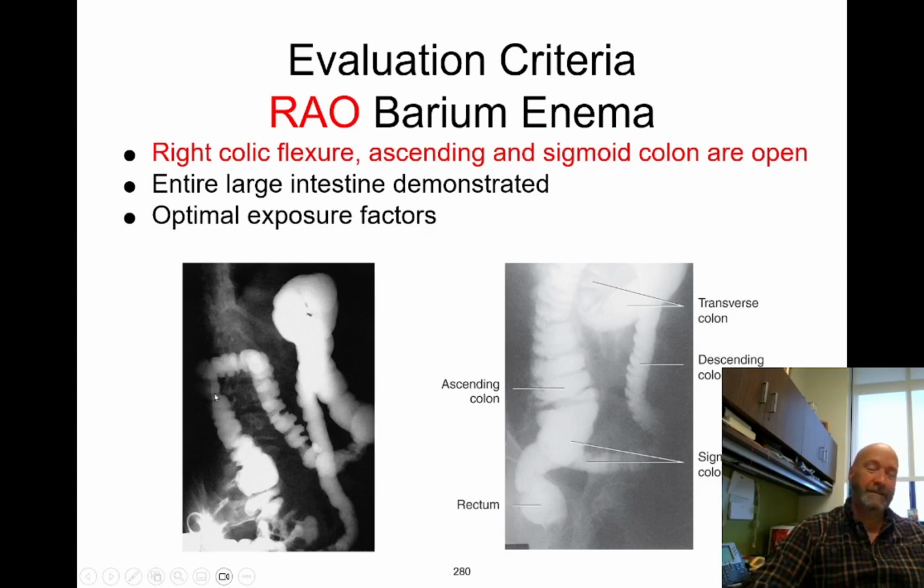So since you don't know exactly where it's going to be, it might be a good idea to position 1 to 2 inches above the iliac crest to give yourself a little grace. They did not do that here. It looks like they positioned at or possibly a little bit below the iliac crest, and you don't see the top of either flexure. This, in my book, is absolutely a repeat.